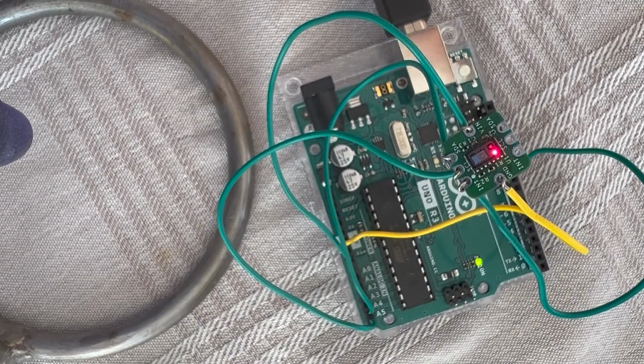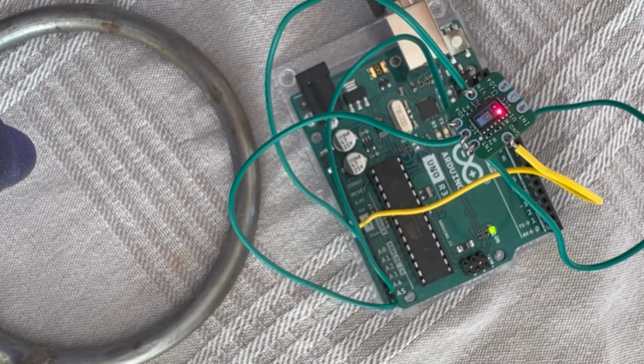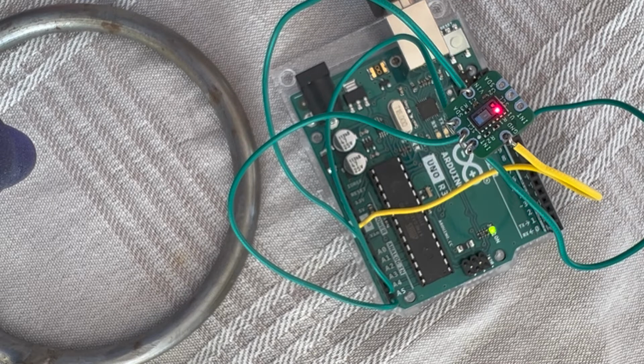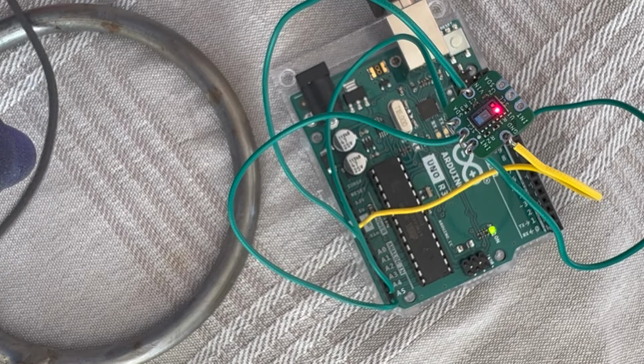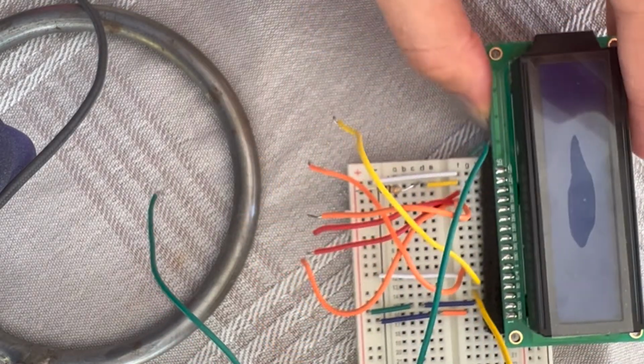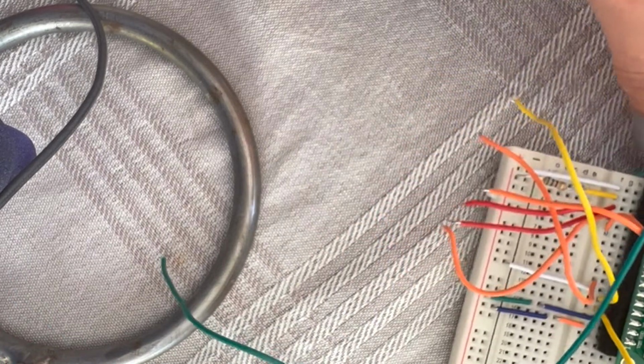Now we can go ahead and connect the LCD, but if you want, you can skip the part about LCD, because we can actually print all the values on serial as well. I'm going to show you using the standard libraries. We can print everything on serial, and you can skip the parts with the LCD connections. So I just move this, and let's look at the LCD. So I had connected this.